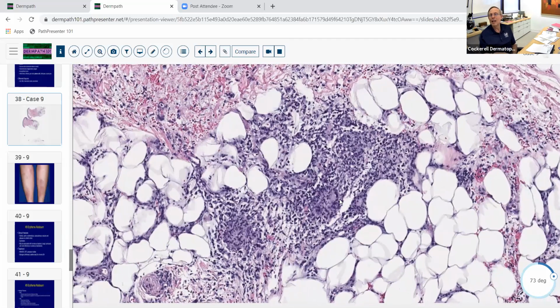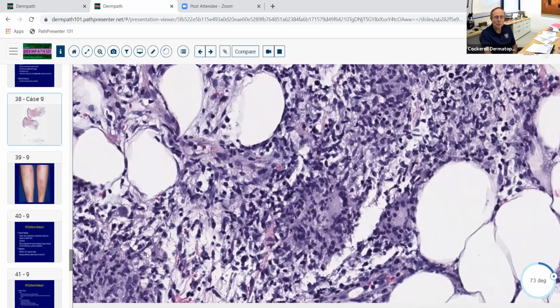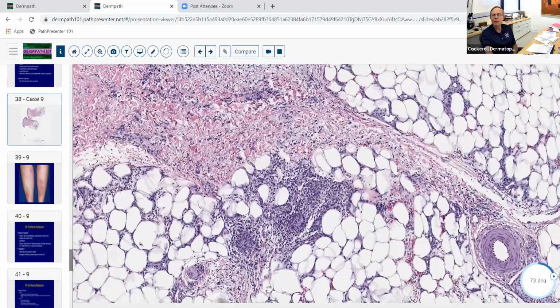Now, I don't use a lot of eponymic names anymore in histology, and I don't like Miescher's radial granuloma. Miescher did lots of interesting things in our field, but it's basically just granulomatous inflammation at the periphery of the thickened septa and the lobules, and they can have multinucleated histiocytes. They can have some slightly epithelioid morphology, so you don't really need to do that. The reason I don't like it is people look at it and say, well, is there Miescher's granuloma here or not? If it's not, it can't be erythema nodosum. Well, wrong. It can be. It depends on what stage of the evolution you're dealing with.